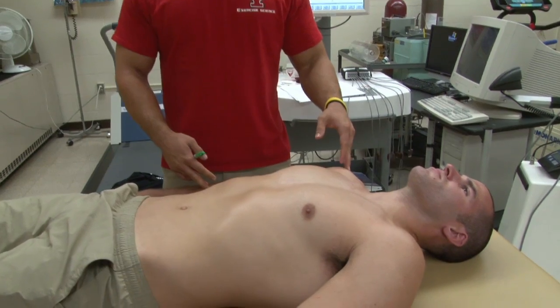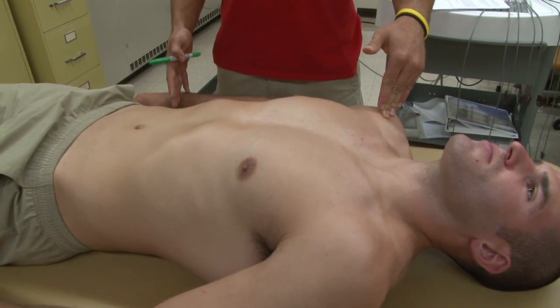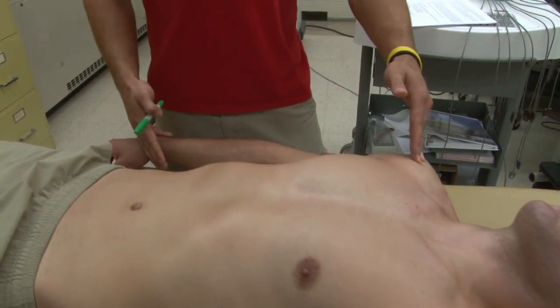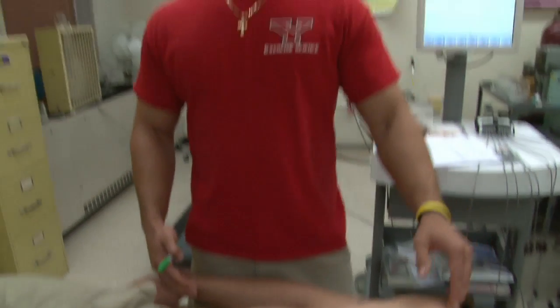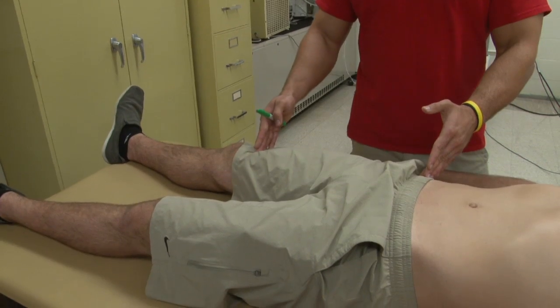Now we're going to start by applying the four limb leads. These differ between exercise and resting. During rest, you're going to place one on the right arm and one on the left arm, in between the shoulder and the wrist. For the legs, you could put it in between the torso and the ankles — so on the thigh. That's for resting.